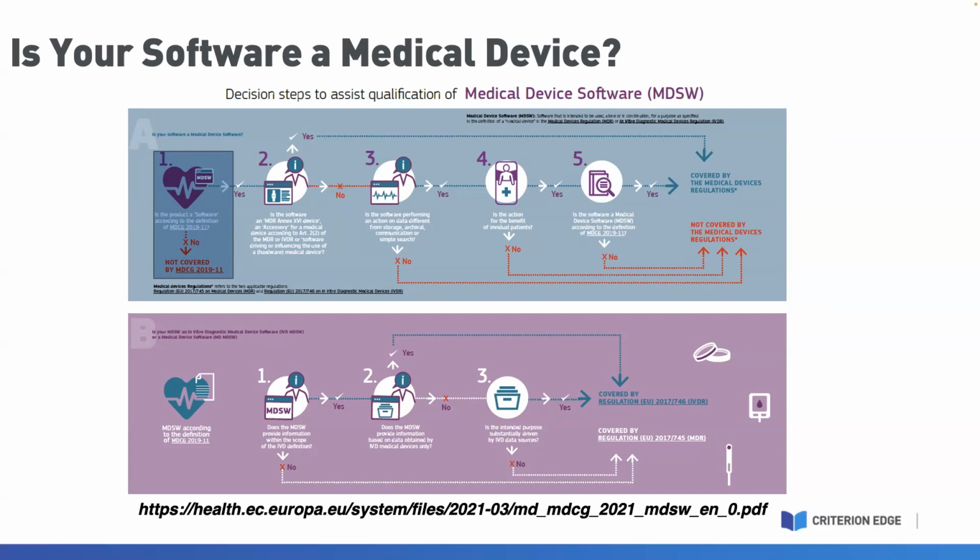So next slide, please. On the IVD side, so that lower portion here in the purple, if we start with the IVD pathway, I think the first thing to point out is that the EU uses this term medical device software. The medical device software, or MDSW, is used in place of that software as a medical device terminology.